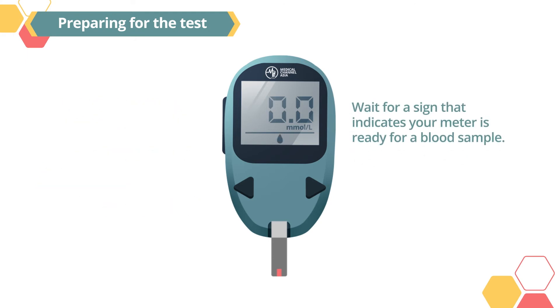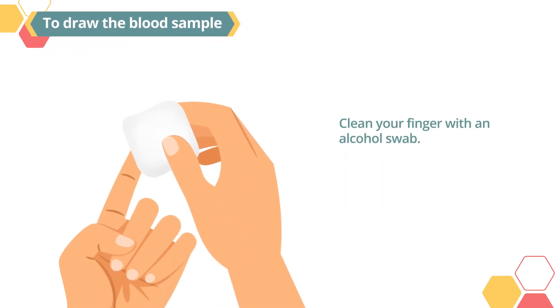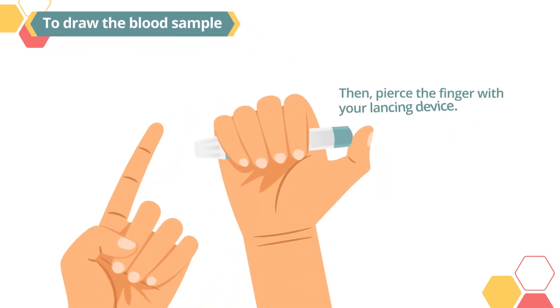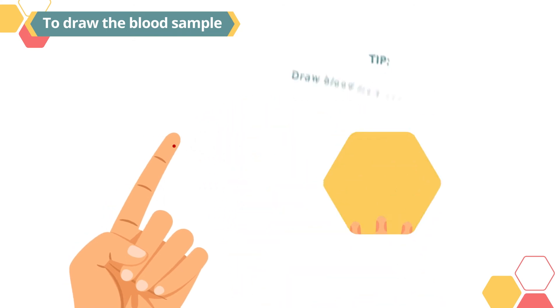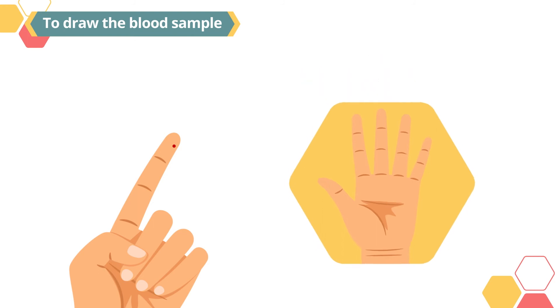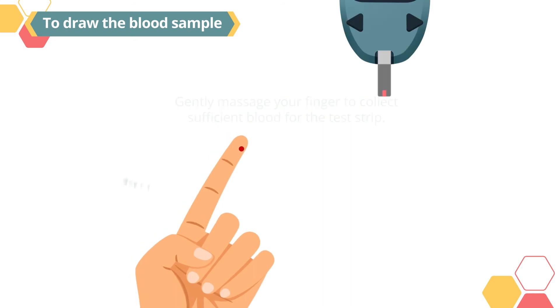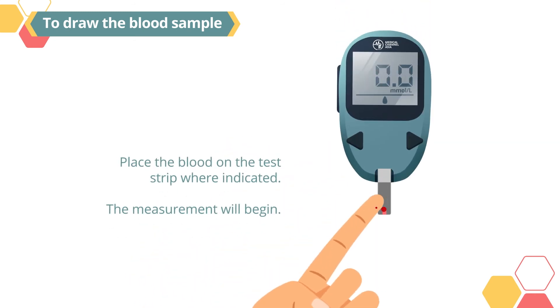Wait for a sign that indicates your meter is ready for a blood sample. To draw the blood sample, clean your finger with an alcohol swab. Then, pierce the finger with your lancing device. Just a tip: draw blood from the side of your fingertips to reduce the pain. Gently massage your finger to collect sufficient blood for the test strip.